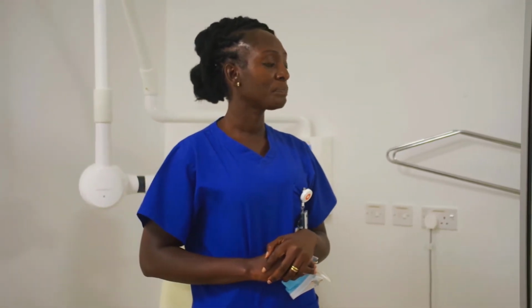Servicing. Well done, Sarah. So yes, you have to make sure that the equipment is serviced regularly, making sure that it is giving you the optimum that you need. Is there anything else that would come under optimization? Viewing conditions? Yes, you're absolutely right. So your viewing conditions should be adequate.